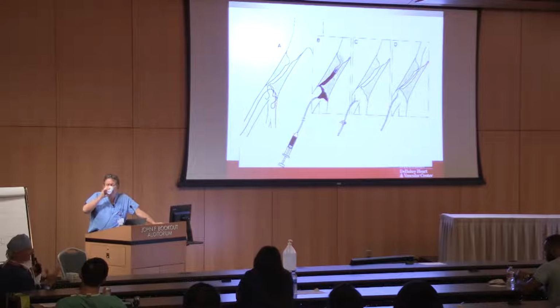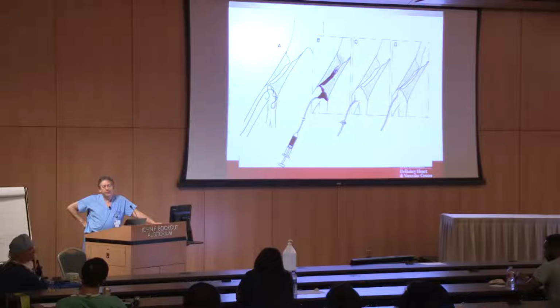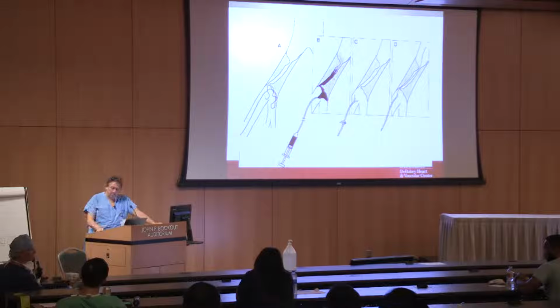So I like to think if I see my hand on the fluoro, that's the same thing as taking my hand and sticking it into a campfire. I'm too close. You shouldn't see your hands under fluoro. These guys, we do it, but it's not a good thing to do. Generally, especially at your age, you need to stay away from radiation. It's important.